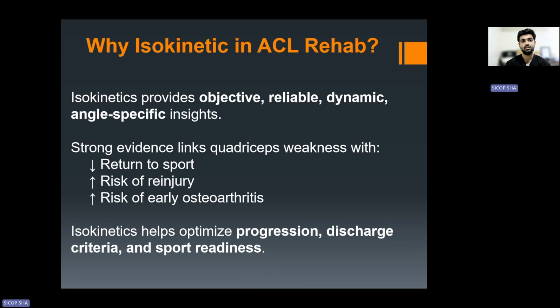Now we'll see further why isokinetic testing in ACL rehab is important. Now we already discussed that isokinetic is a reliable, evidence-based method for testing knee ligament or knee muscles.